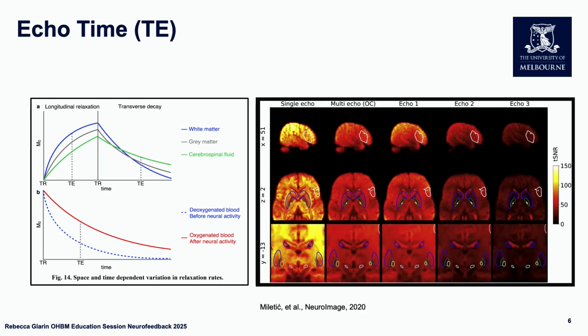Now, we wouldn't use multi-echo fMRI or MRI for neurofeedback, but it's just an example to show that you're getting this stronger contrast to noise in that first echo. So if you're wondering, maybe I should be trying a later echo, the signal just isn't there, and it supports this, as we see over here, that it's okay to shorten that TE.